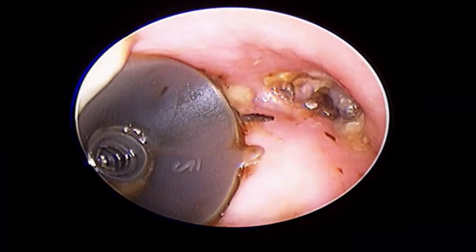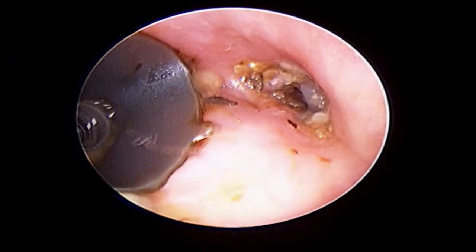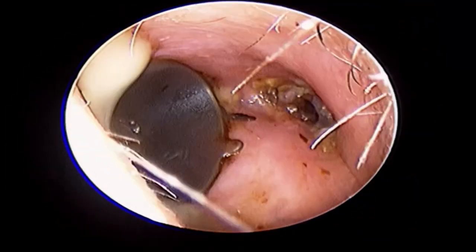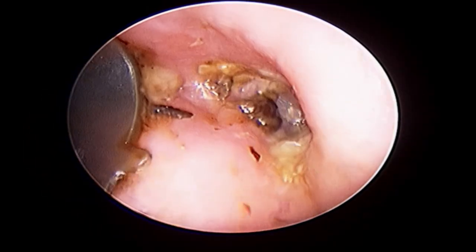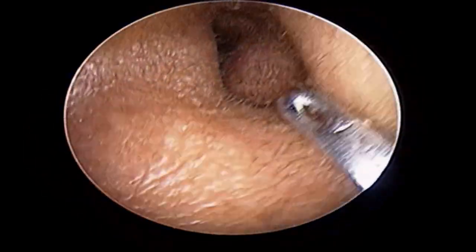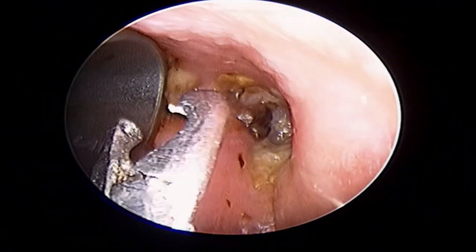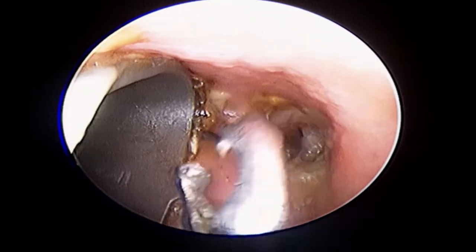The same patient visited a few years back with the dome stuck at that time. It was very dirty and he had forgotten it too. The doctor this time also removed it easily and cleared the underlying wax and debris.